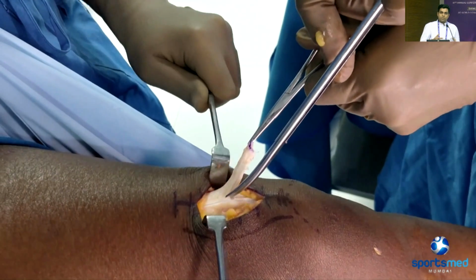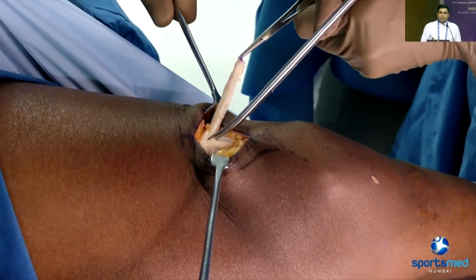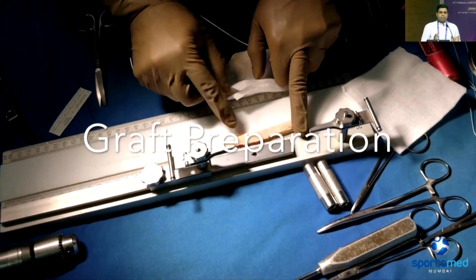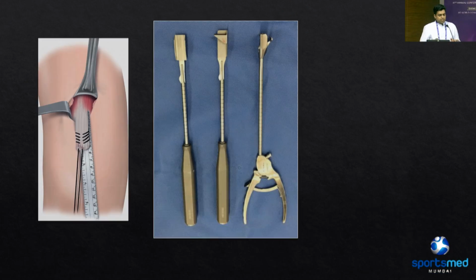So you can opt for taking only the superficial slip of the soft tissue central quadriceps tendon by using a small incision such as this, and get a decent enough graft of around 8 millimeter, 9 millimeter for applying in a primary ACL reconstruction scenario.